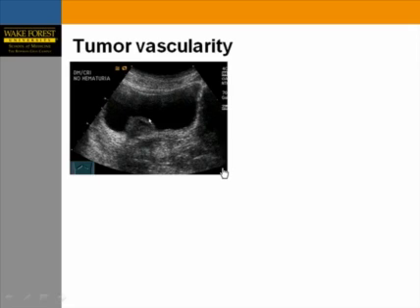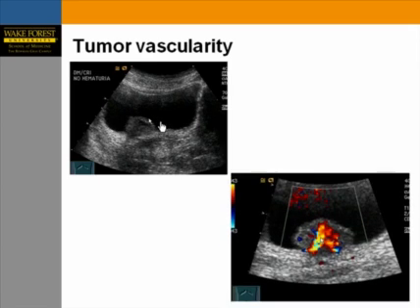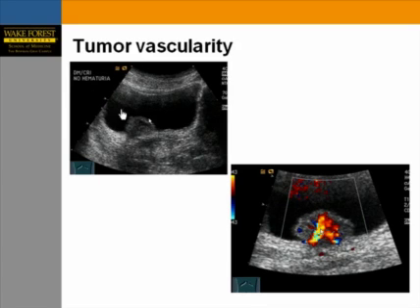Another patient referred for renal ultrasound had a soft tissue mass incidentally identified in the bladder. Color Doppler showed it was avidly vascular. The patient had no hematuria, but was taken for cystoscopy and biopsy-proven transitional cell carcinoma — asymptomatic.